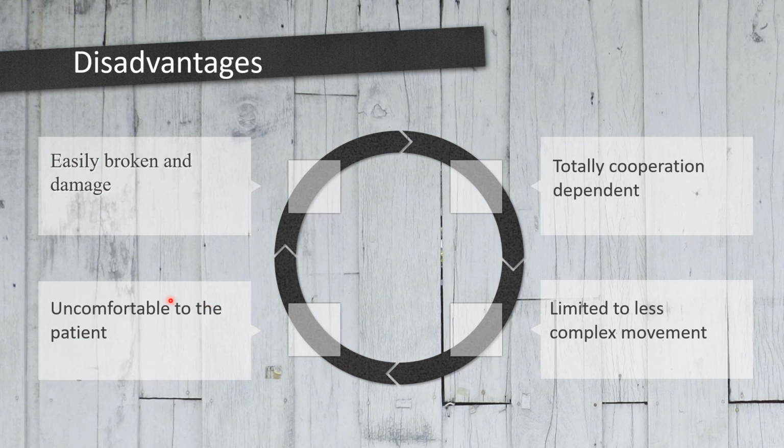It is uncomfortable because of the large base plate of the appliance that may affect the phonetics of the patient and increase salivation. It is also easily broken and damaged during handling.